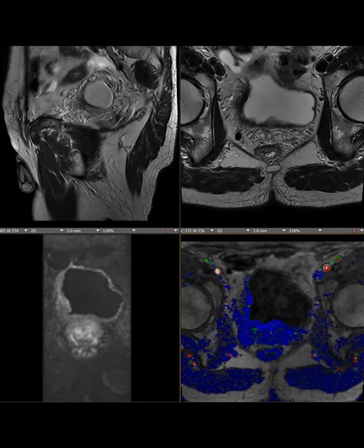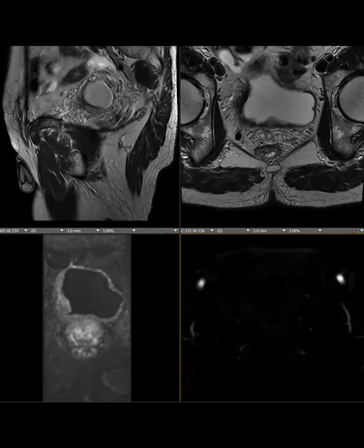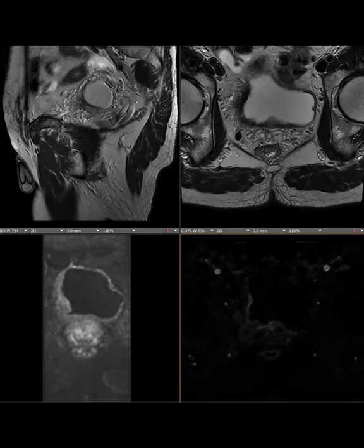I think that T2 also nicely shows it going beyond the muscle. So that's a good way that MR can help you stage it. I totally agree. I think this one's even better. Let me get you this one. That's not the one. Where you do see the enhancement right there. That looks pretty convincing. A little dark on my screen, but. Yeah, sorry, it's a subtraction. I see, we're convinced. Okay, great. I'm convinced once you have the pathology, right?